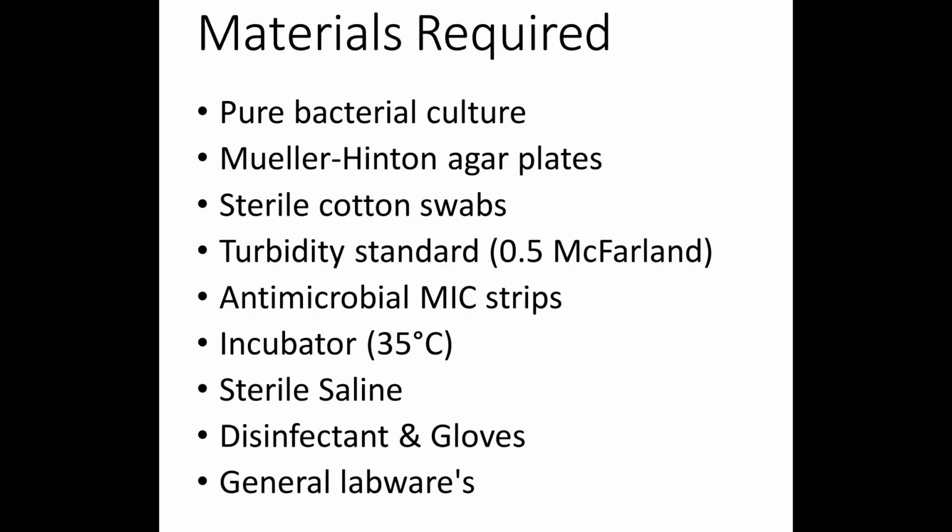Like the standard disk diffusion method, the materials and procedures remain mostly the same. However, in this test, we use the MIC strip instead of a disk, allowing us to measure the quantitative susceptibility of microorganisms, that is, the lowest concentration of an antimicrobial agent that inhibits visible growth.